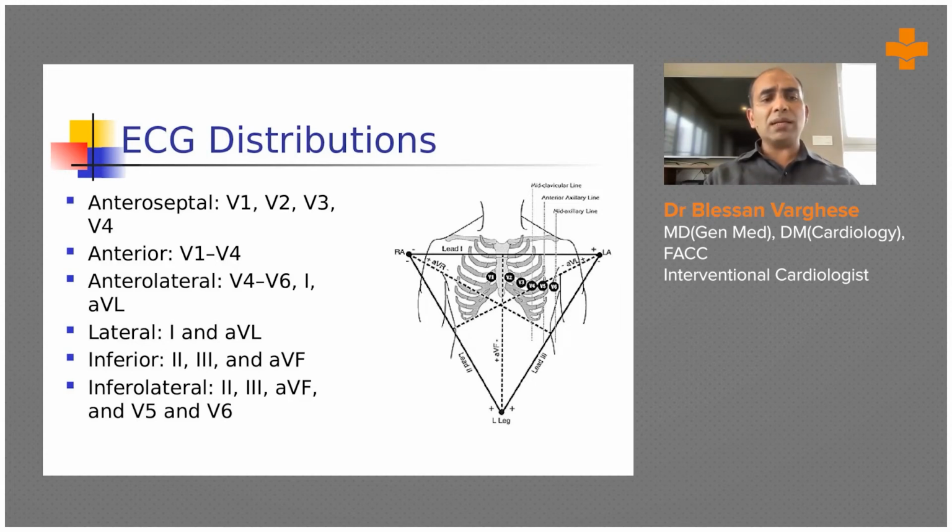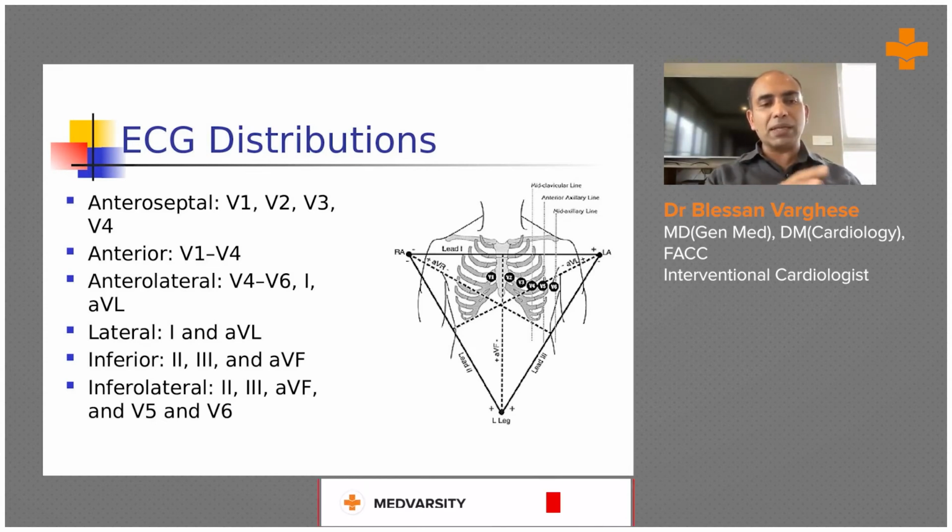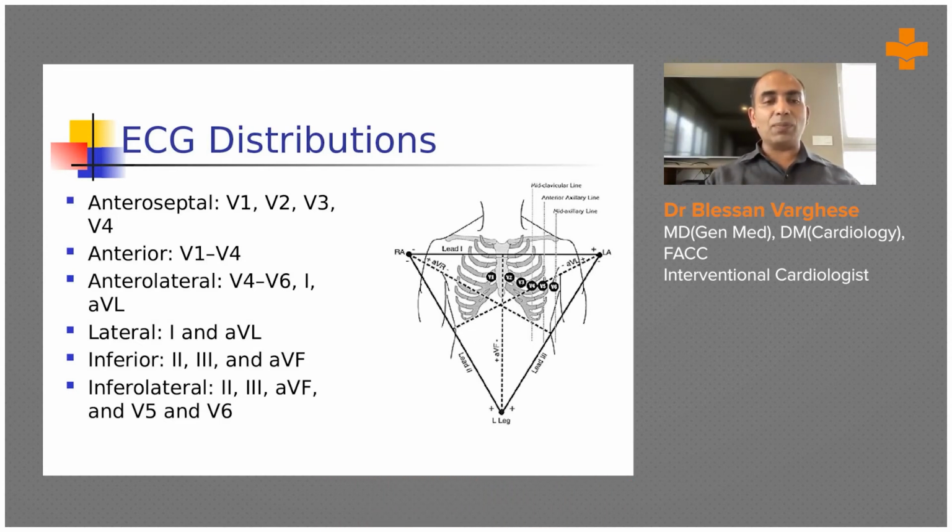This is very important, and you should all remember that where the precordial leads are placed represents each wall of the heart. This is clinically important. Even if you don't remember any of the previous slides, this representation and these representative leads should be memorized, and should always be at your fingertips for a correct interpretation of the ECG.